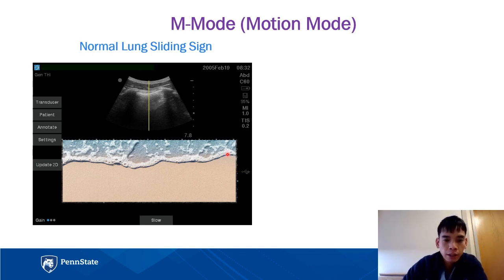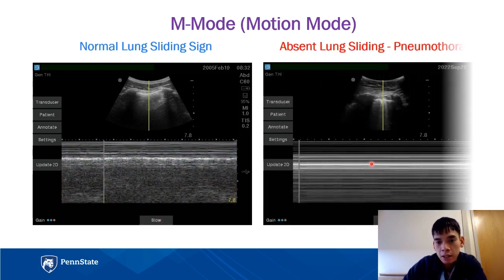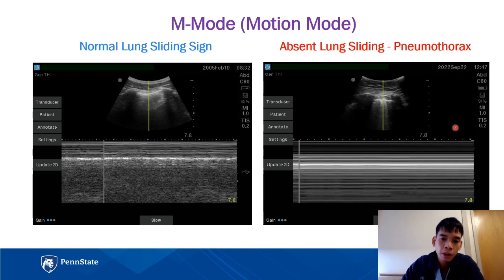Okay, so again, the skin, musculoskeletal layer, and bones, ribs are stagnant, while your lungs are inspiring and expiring, which looks stippling, right? In contrast, when there's a pneumothorax and there's pressure and the lungs are having difficulties inspiring and expiring, then there won't be any motion at all within your lungs, because it's at a standstill because of the pressure.